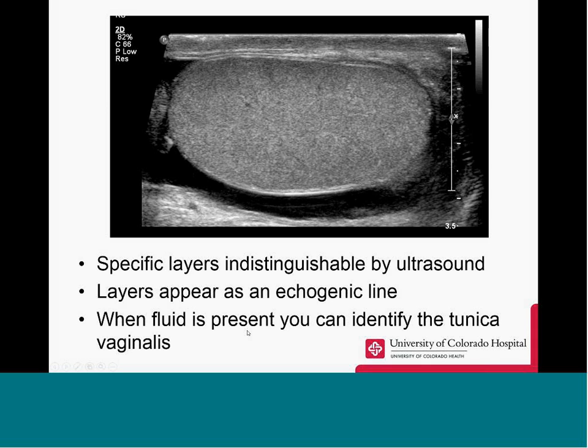The separate layers are indistinguishable by ultrasound. However, you can identify the tunica vaginalis if there is fluid present. Here, this is a physiologic amount of fluid, and there are echogenic layers delineating our tunica layers.